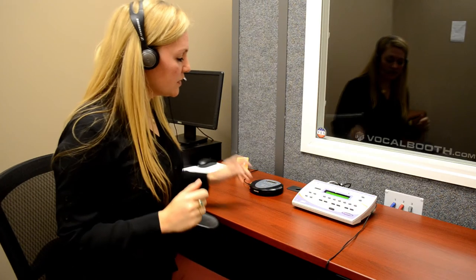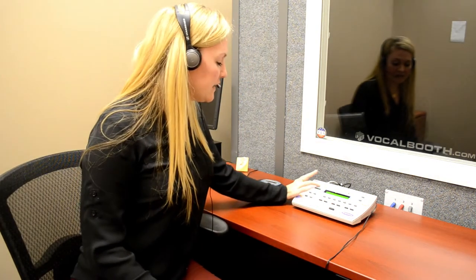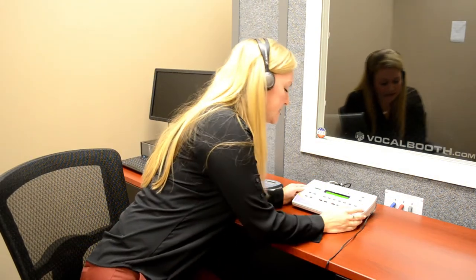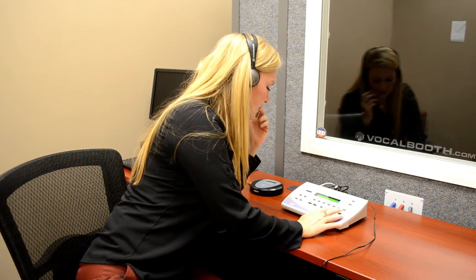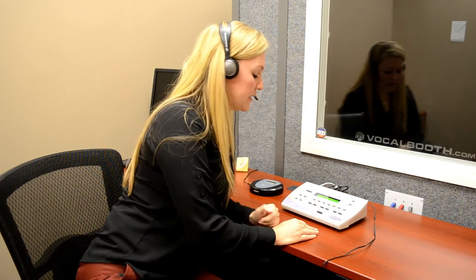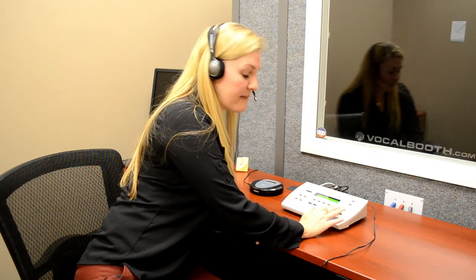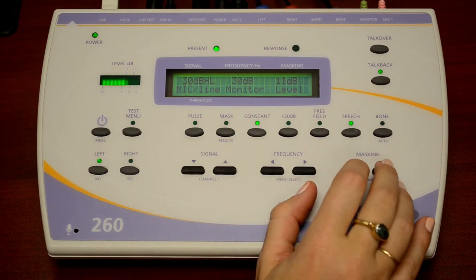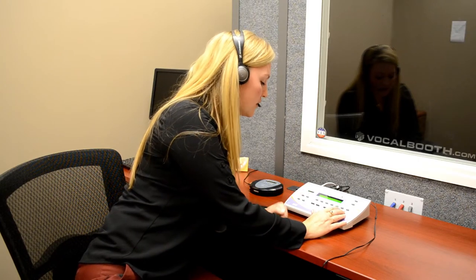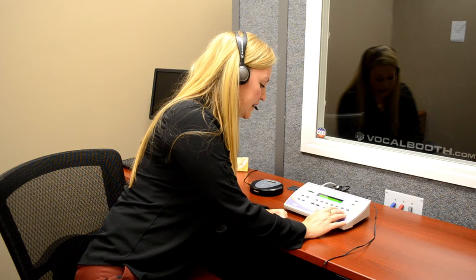So the first thing you want to do is check out the level dB. That's where your VU meter is. And to increase the level for the VU meter, you are going to just press the masking buttons. So right now we can see that my voice is not meeting up to the 0 dB level. So now I'm just going to increase it until we do.